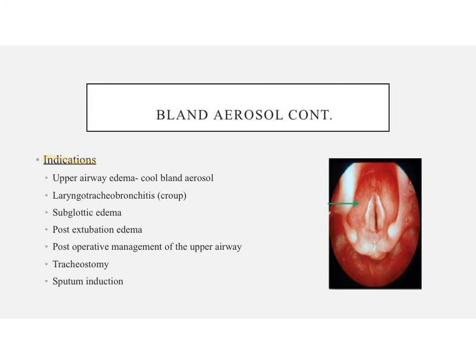So this is a picture here of some subglottic edema or post-extubation edema, and you can tell that the airway is compromised by this swelling. So you want to make sure that you are getting cool mist aerosol, because heat is going to help the vasculature open up, and we don't want further swelling or inflammation. We want cool mist to help promote that constriction.